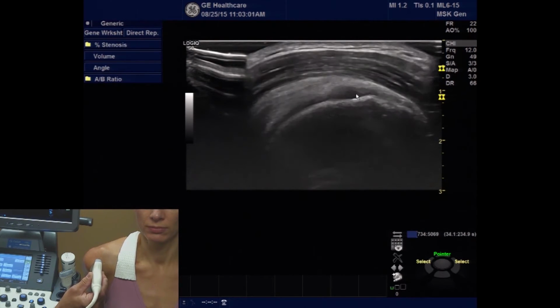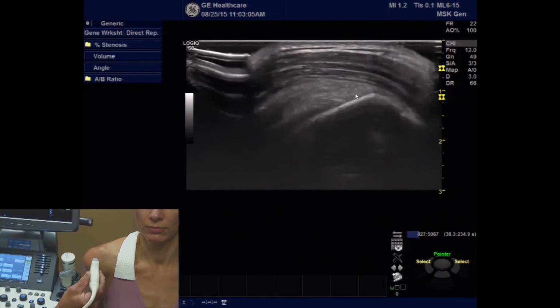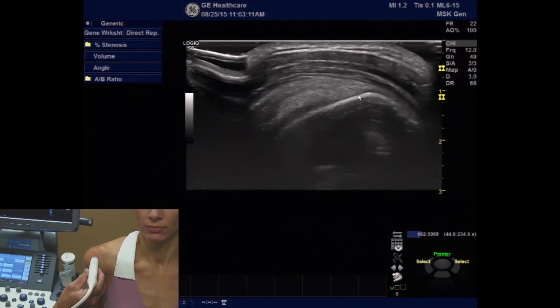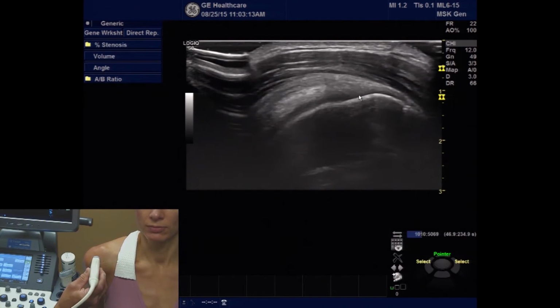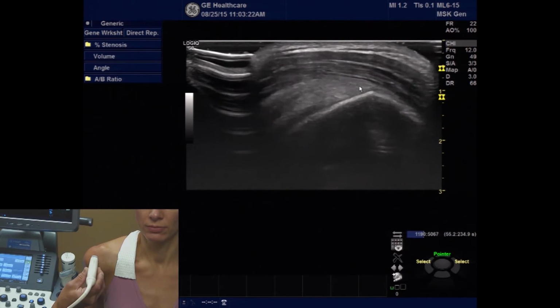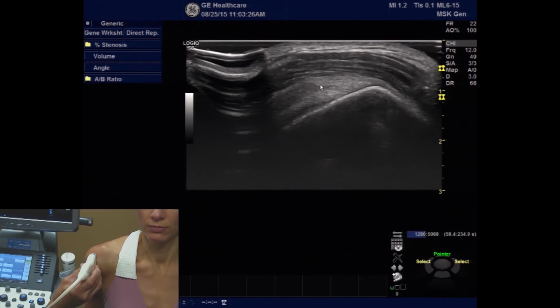And we always will find the slight area of hypoechoic area, again, which is pure anisotropy. So I'm heel-toeing the transducer to show that the fibers are in contact and the bone surface is nice and smooth. Continuing to move the transducer out, again, I will see the humeral head, the anatomic neck, and the tendon of the supraspinatus. Continuing in my outward movement, now I will move out laterally and posterior, where I'll see the infraspinatus tendon insertion onto the greater tuberosity.